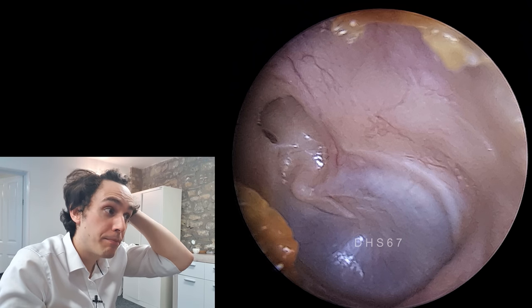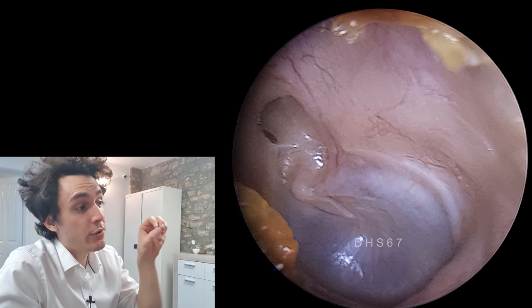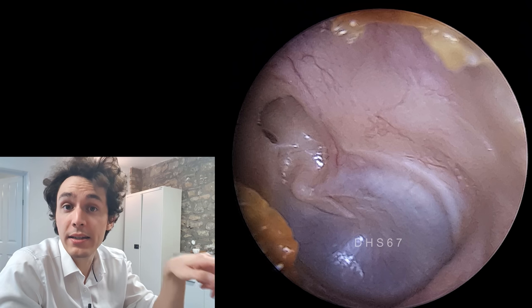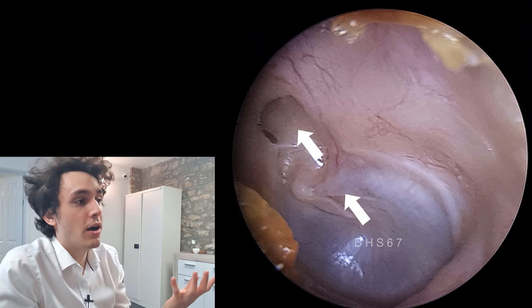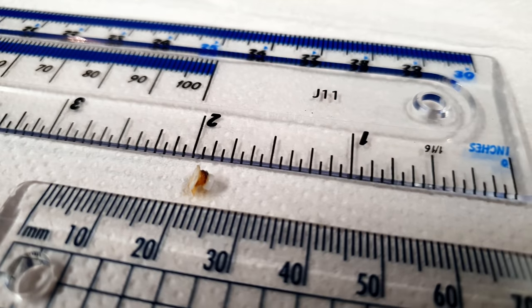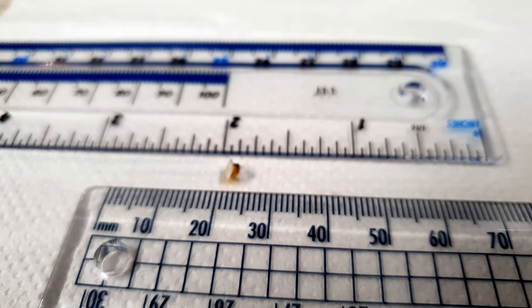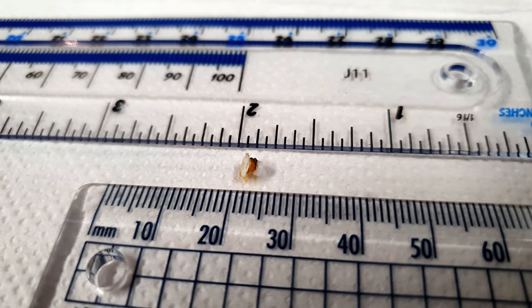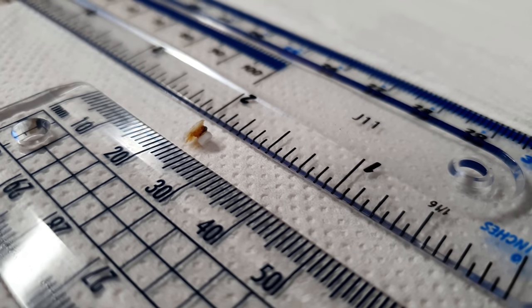A cholesteatoma is basically a growing sack or ball of dead skin. Skin will migrate out from the center of the eardrum — which is normal — it grows outward in all directions, and it will inevitably migrate into that pocket and get trapped. More skin will go in, more skin will go in, and because it can't get out of that pocket, it will just form into this huge ball. As the cholesteatoma gets larger, it will start to press on certain things — it can erode the ossicles.